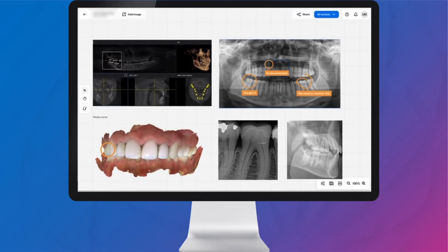Through DSCore, every intraoral scan, intraoral x-ray, and CBCT is automatically transferred to the cloud for a complete digital chart accessible from all my devices anywhere in the world.